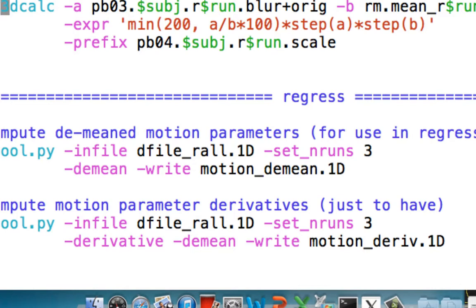We now come to scaling, which is the last step before running our regression model. With scaling, what we want to do is put all of these arbitrary MRI signal units for each subject and for each run onto the same scale, so we can actually do comparisons across runs and across subjects.